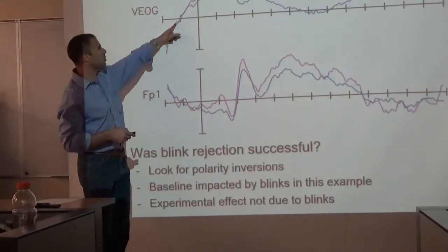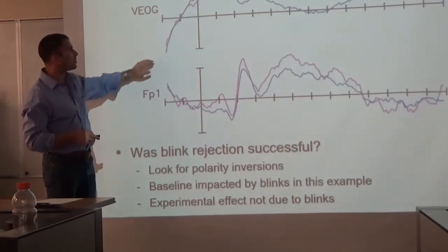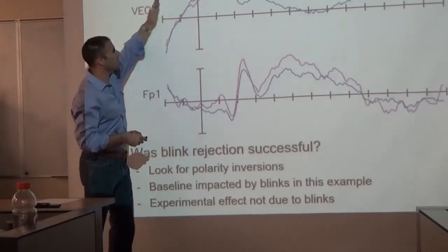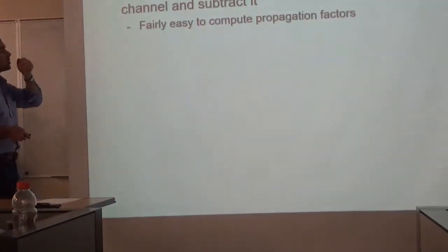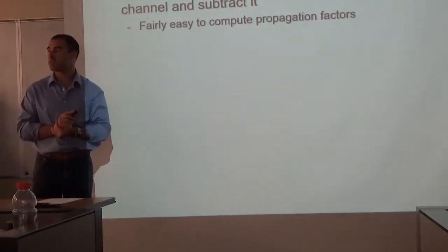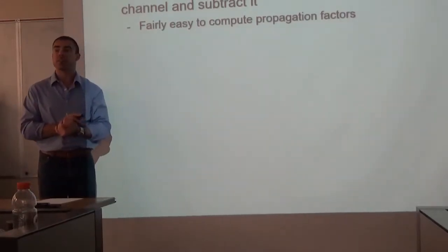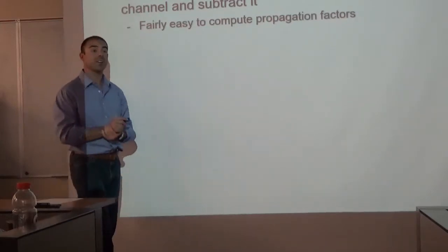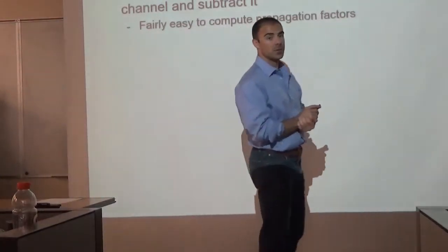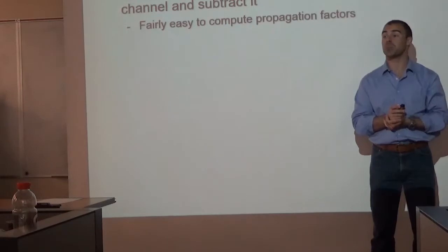Again, we looked at some inclusion of blinks and what that might look like, and how you can tell in the data if it's bad. So you don't want to see this. You want to see before the stimulus comes on the screen, you want it to be relatively flat. And so the last thing that we'll touch upon in terms of artifacts like this is the idea that we can correct the artifacts too. So remember I mentioned independent components analysis? ICA. This is one way to correct the artifact and keep the data. So in this way, you keep both the baby and the bathwater. You just clean the bathwater.